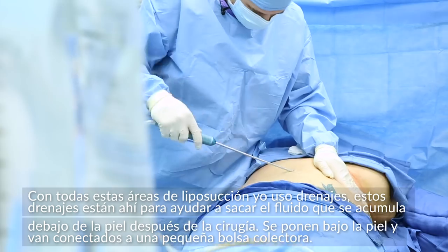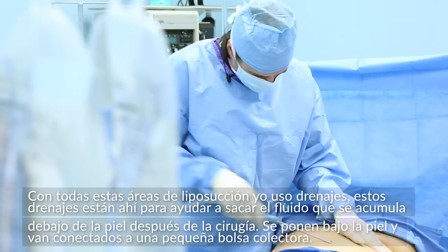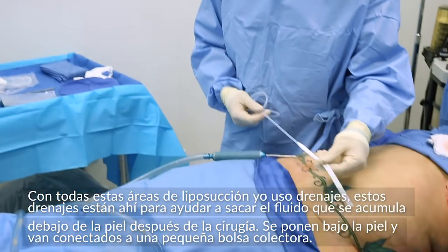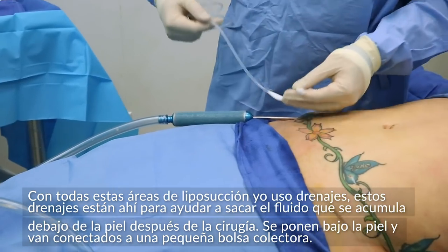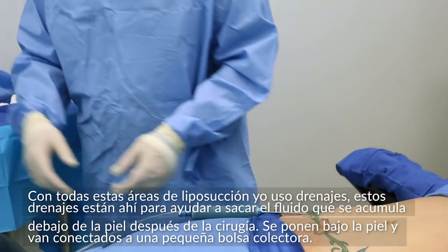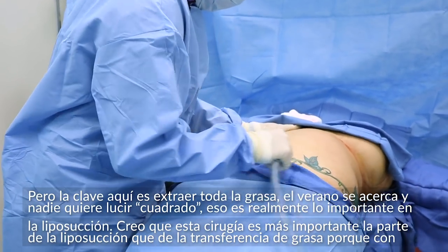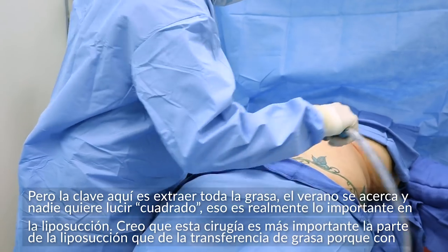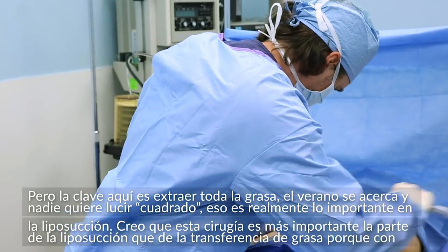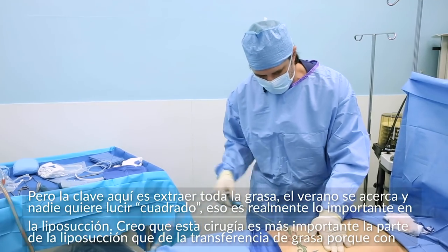I do use some drains — the drains are there to help with the fluid underneath the skin afterwards and prevent the accumulation of fluid collections. They go underneath the skin, one in the lower abdomen, and collect into a little collection ball. The key thing is just getting all the fat. Everyone wants to have a good shape — nobody wants to be a square.